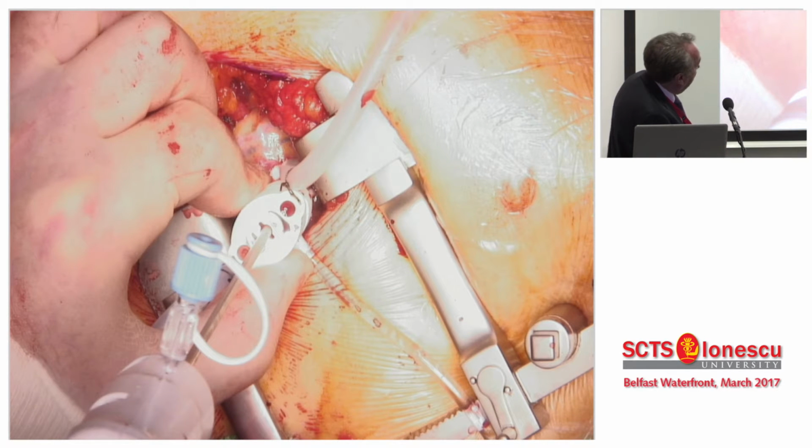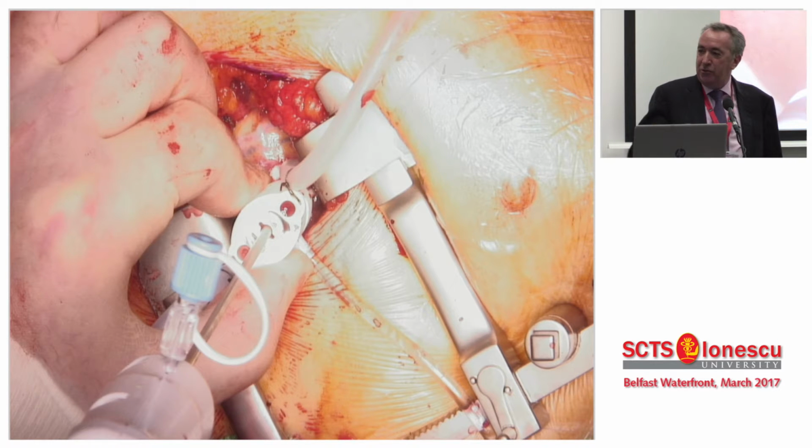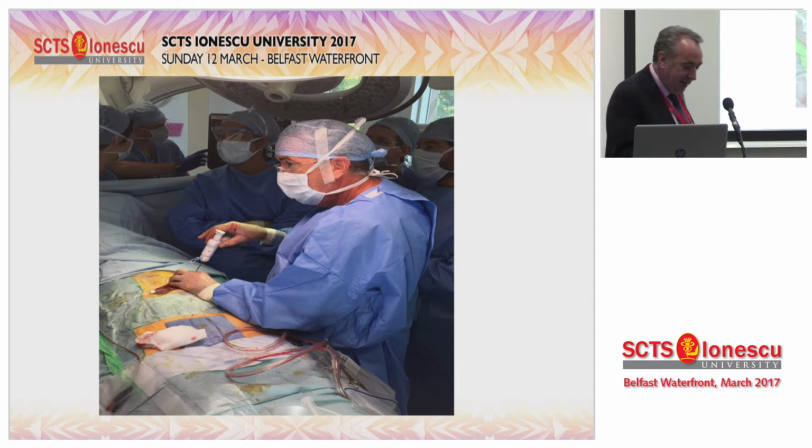It comes with a valved introducer that's a 9 French, so really quite low profile sheath. So you can put about 4 sets of cords in through this one valved introducer before having to take it out. So again, sort of slightly ergonomically easier.